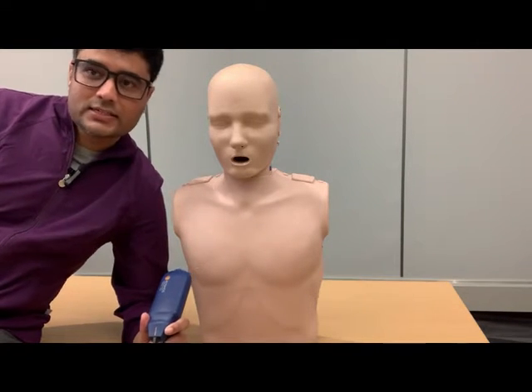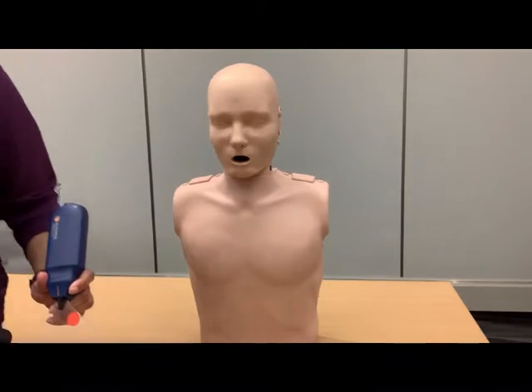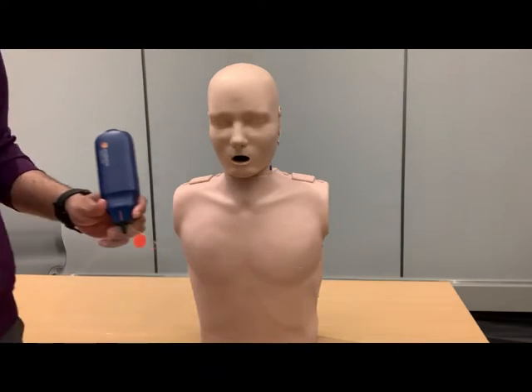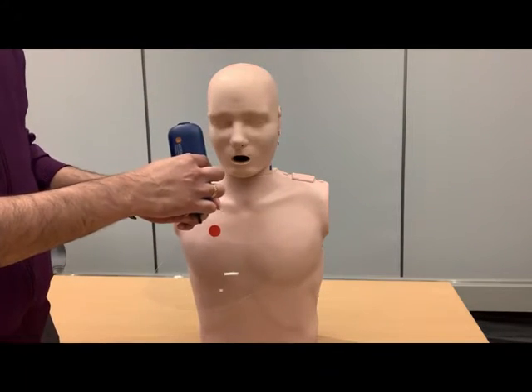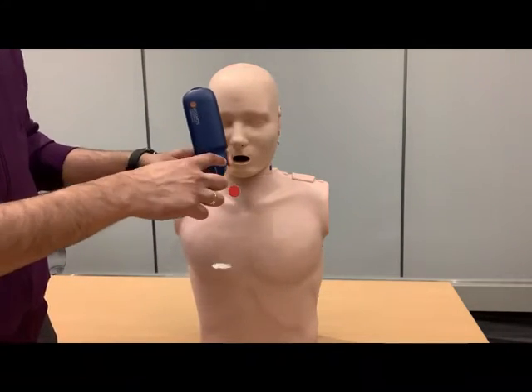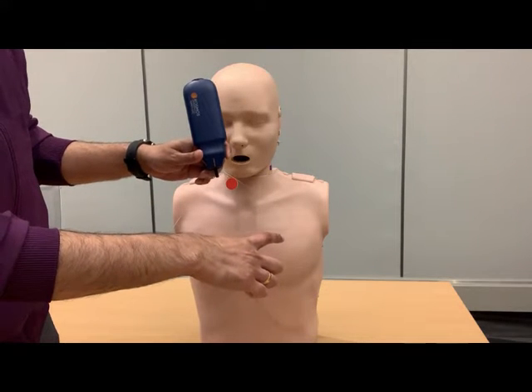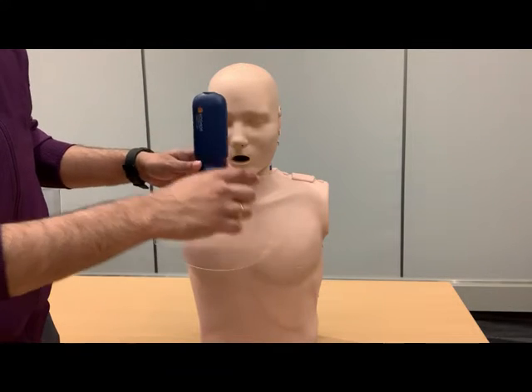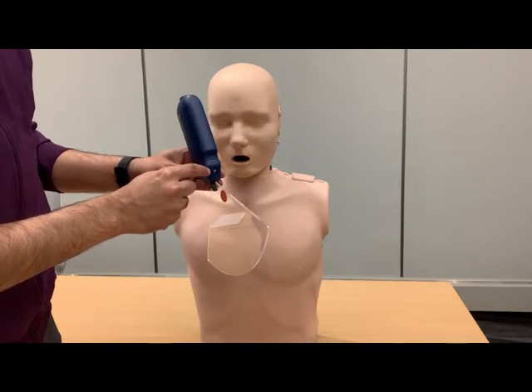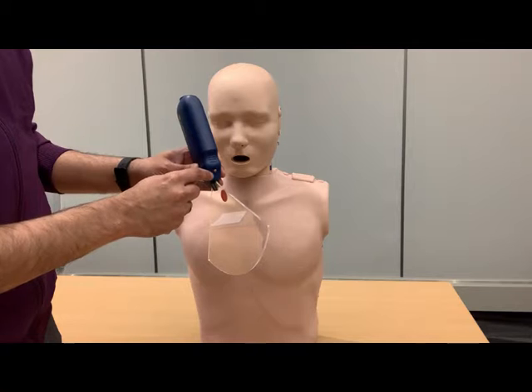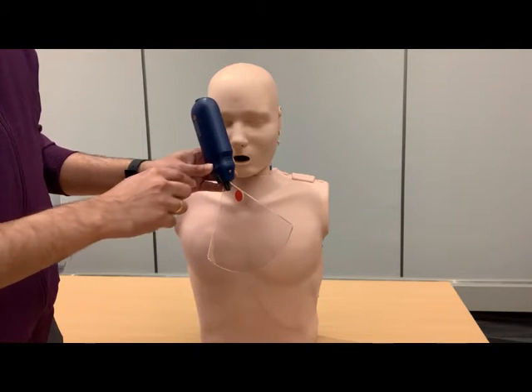First, let's talk about the image orientation principles. Here is the ultrasound transducer, and imagine this is the beam coming out of the ultrasound transducer. Every transducer has an orientation marker — you can call that the probe marker.